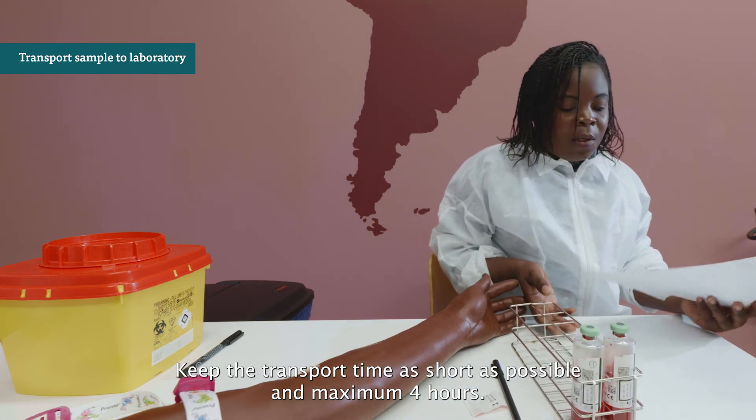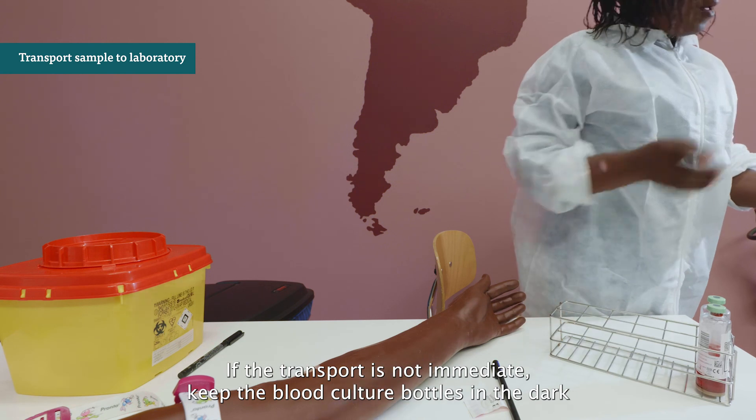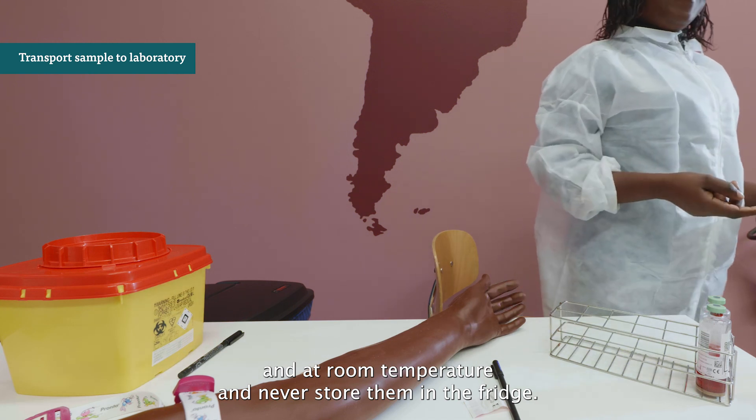Check if the bottles are labeled correctly and transport the bottles immediately to the laboratory. Keep the transport time as short as possible and a maximum of 4 hours. If transport is not immediate, keep the blood culture bottles in the dark and at room temperature, and never store them in the fridge.